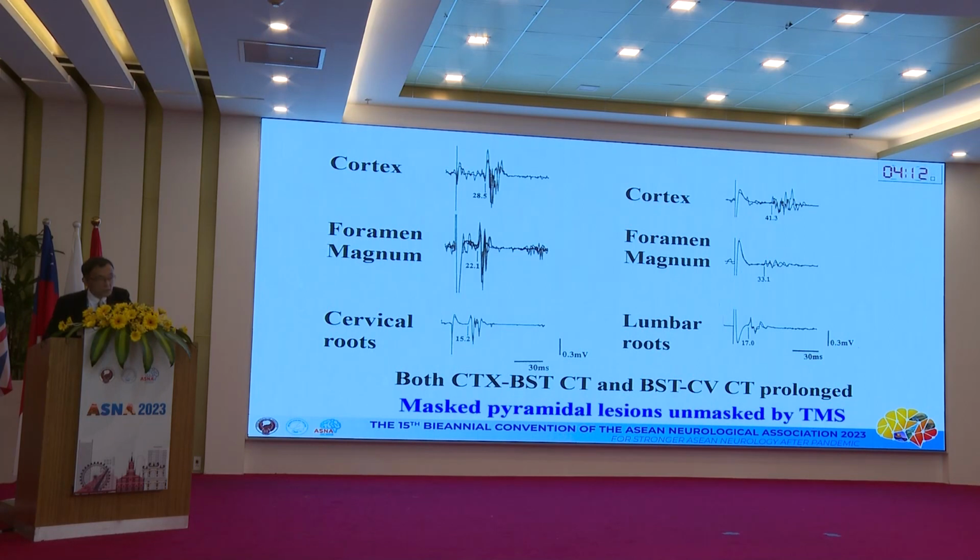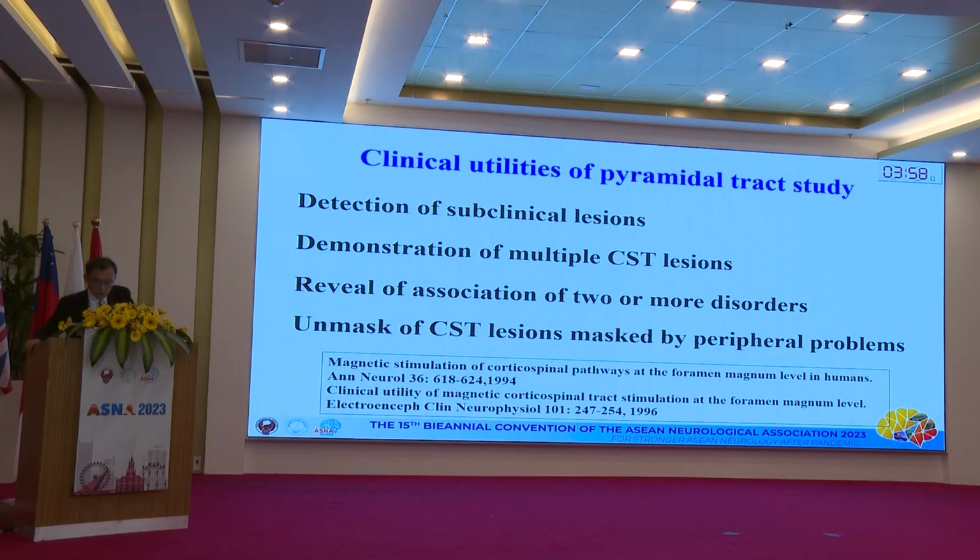So these are examples, and if you prudently use TMS, we can get more advanced information. This was already published 30 years ago. Anyway, that is the old one, but maybe there is a new one somewhere.